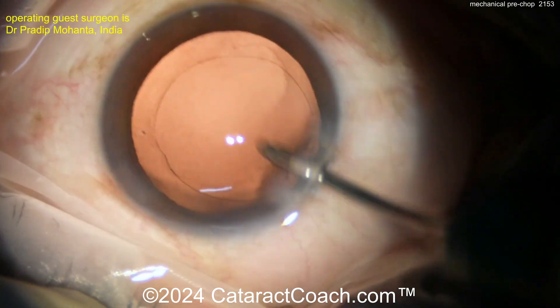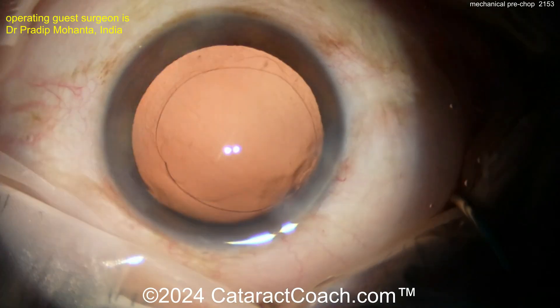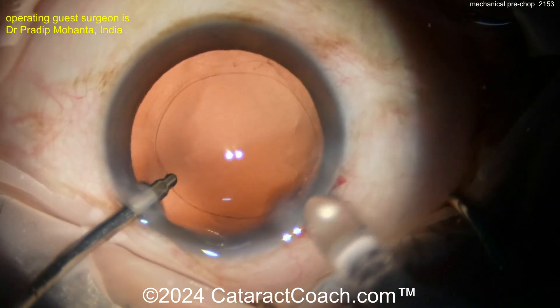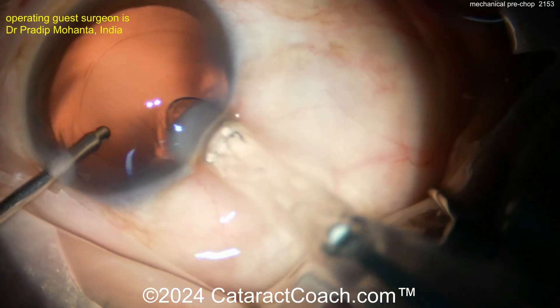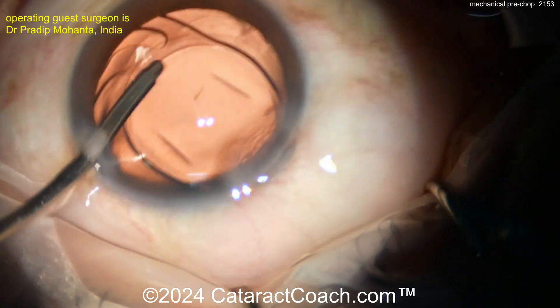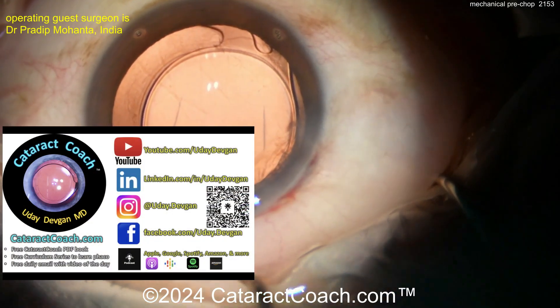These instruments look very useful and work very well — give them a try. You can see what was accomplished with a nice five to five-and-a-half millimeter capsulorhexis. Here's hydro implantation of the IOL going into the capsular bag very nicely — get that centered up. Beautiful.